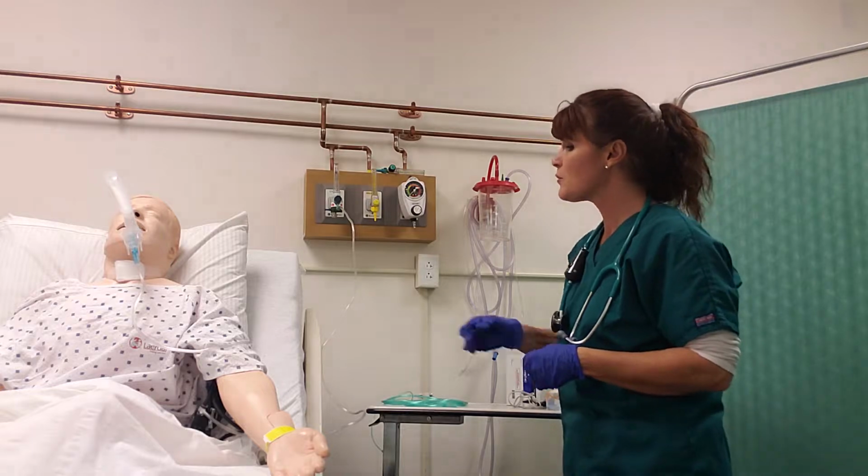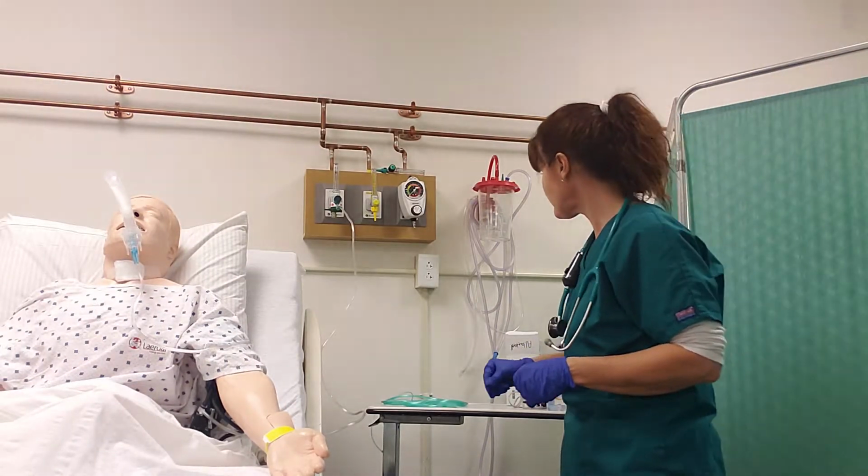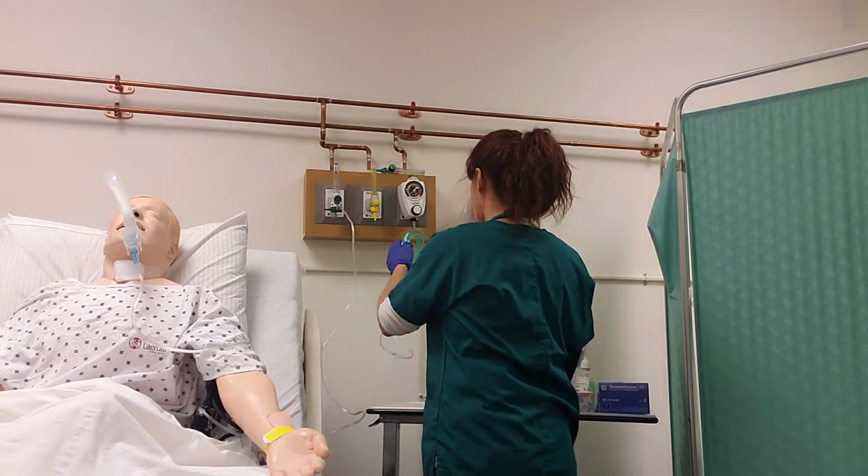Okay, Mr. Wilson, so while you're doing that, I'm going to get you set up on some oxygen that the doctor ordered. Okay.